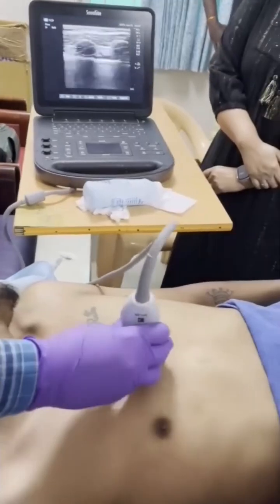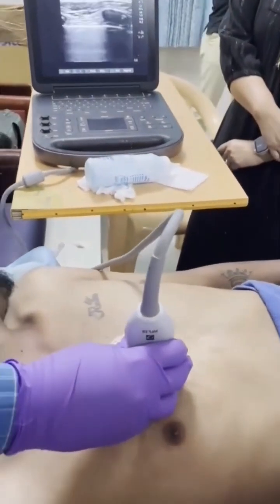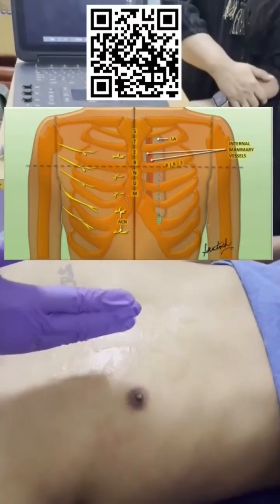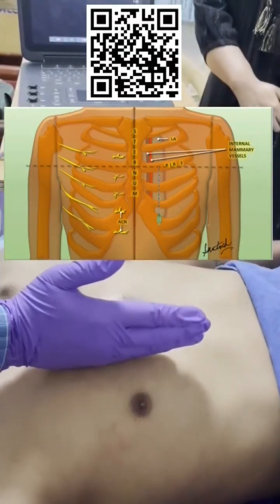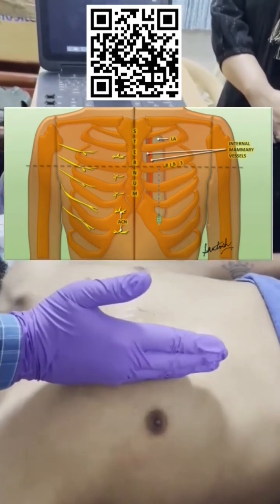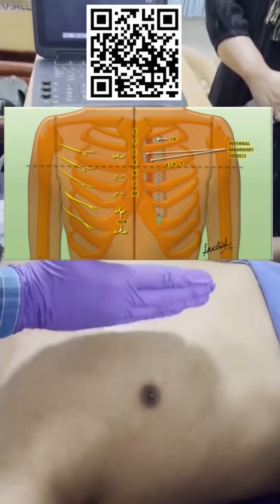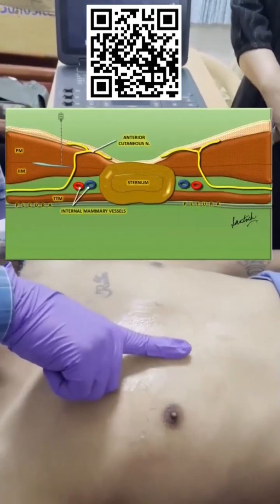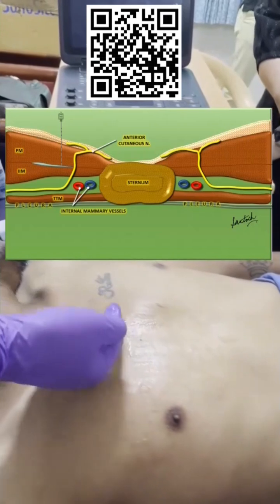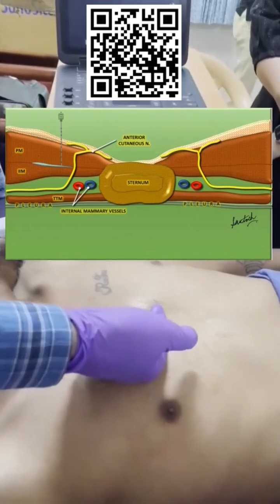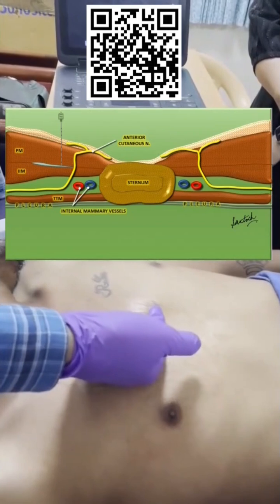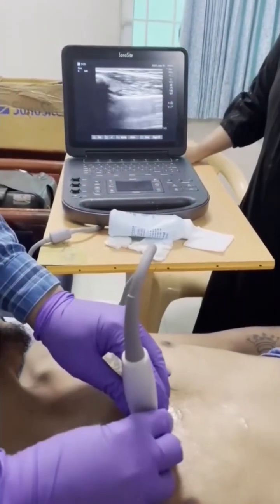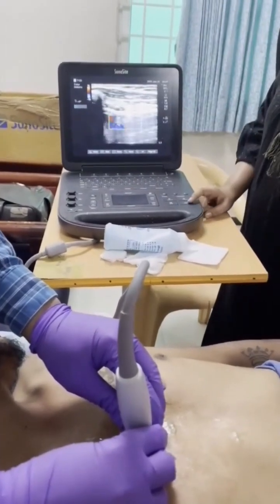Either of these two is okay. Now, regarding the risk — if we scan in this orientation, we might miss the artery. Because the internal mammary, or internal thoracic artery, travels longitudinally, parallel to the sternum, within 3 cm from the sternum. So if it is going longitudinally and you scan longitudinally, we will miss the artery. That is why whenever you are planning to perform this block, you scan in a horizontal or transverse direction. So we will tip the probe here and go lateral — can you see the blood vessels there? That is the artery, and the vein will be associated with it.